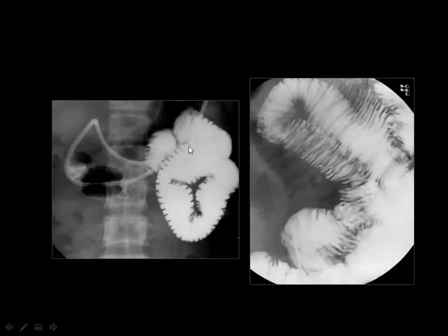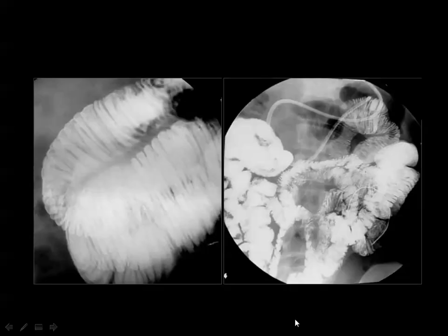You see here is the tube, and we start injection of barium, and you can see the beginning of the jejunal loop. Then if you inject the methyl cellulose, you will see the appearance much better, and this is known as double contrast study of the small bowel. And there is adequate delineation of the mucosal folds as well as the whole segments of interest.